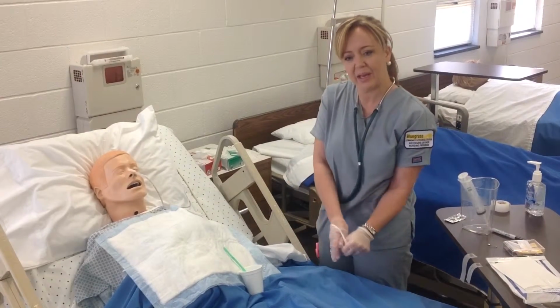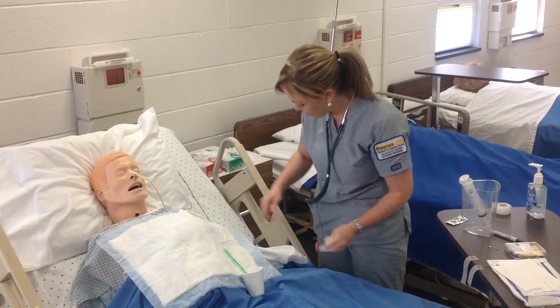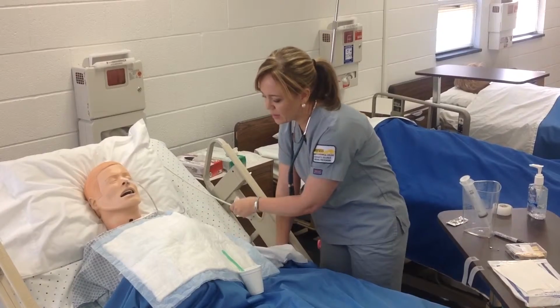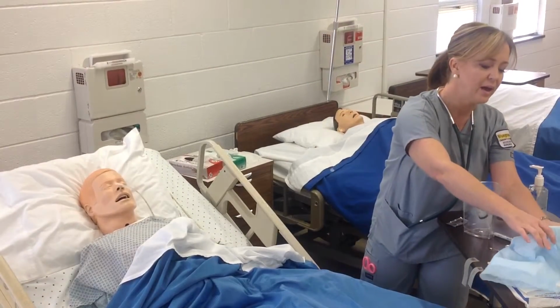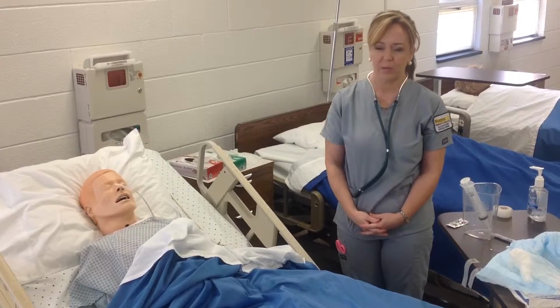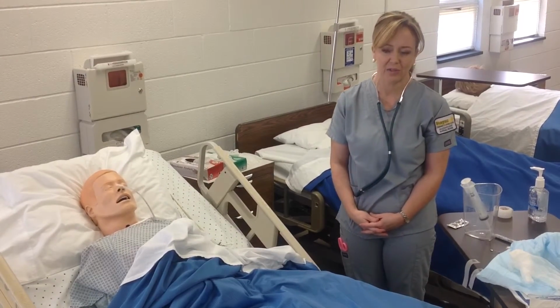I am going to remove my gloves, do my hand hygiene, and put him in a comfortable position. Give him his call light back and clean up my area. So I would document the procedure performed with the tube length and how the patient tolerated the procedure.